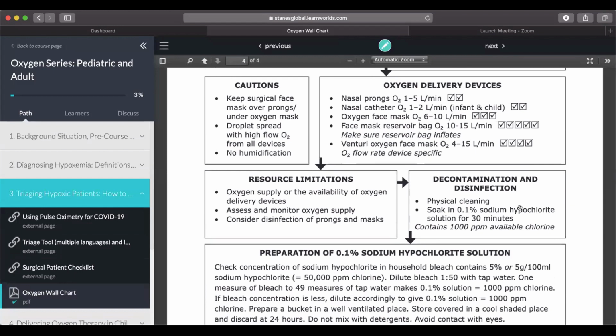So if there is a mechanical ventilator or an intensive care unit or a higher way to deliver oxygen, you need to consult those resources at this point in time. So as soon as you move to a non-rebreather face mask, that's when you need to start thinking ICU, if available, or transferring a patient to a higher level of care if that is available.